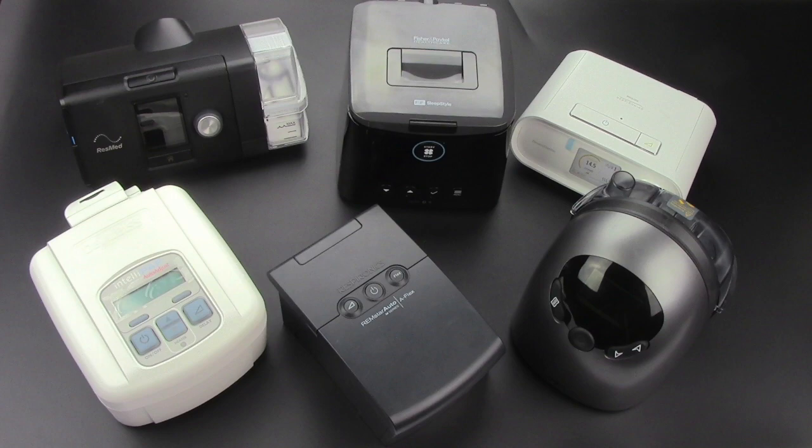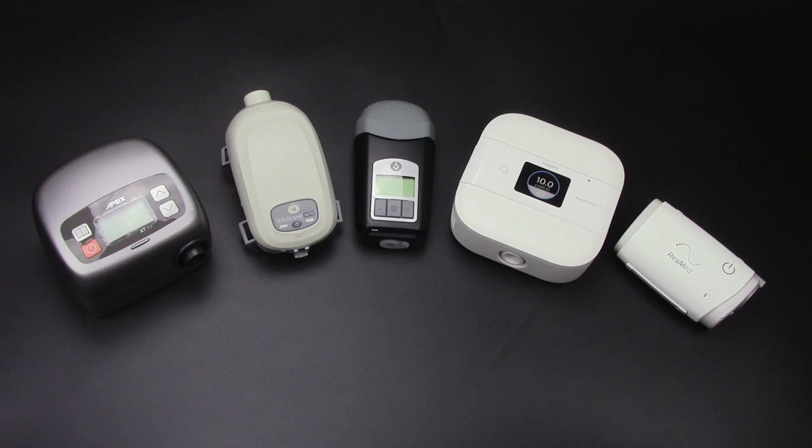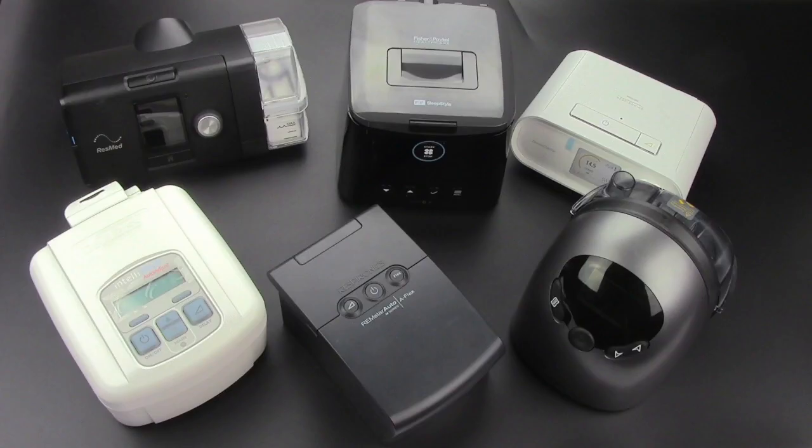The only thing to really keep in mind is that every modern CPAP machine comes with a universal power supply, which will allow you to plug into a 110 all the way up to 220. So the only thing you would need is a wall adapter for whatever country you're in to use their plug-in format. Beyond that, you wouldn't need any other cords or adapters, which makes it pretty straightforward when plugging into a wall regardless of where you're at.